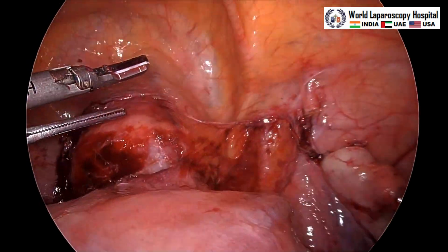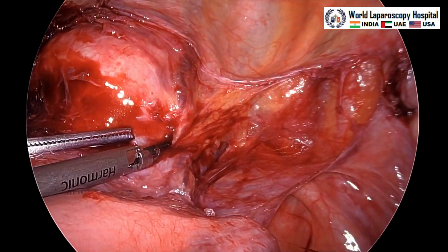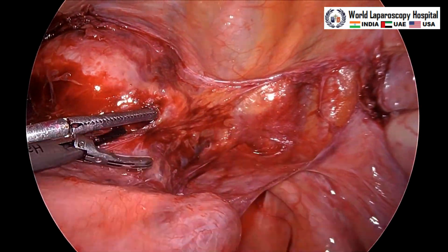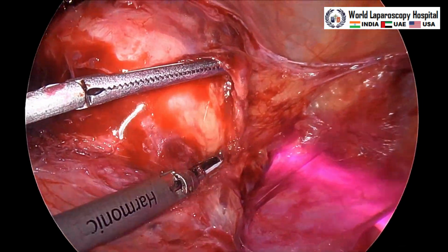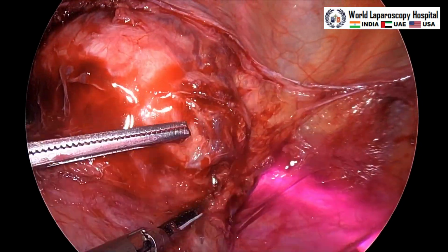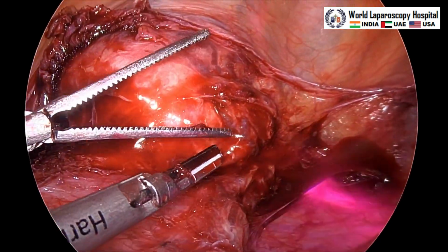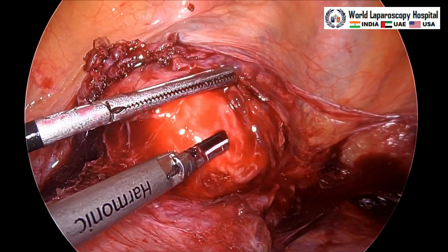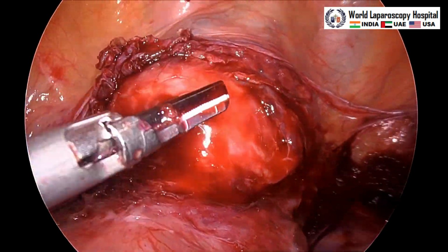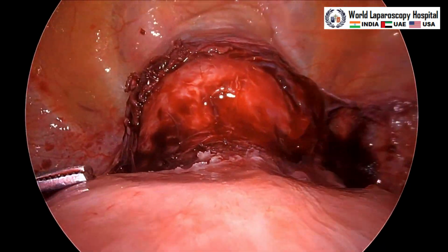Now again we will separate the bladder pillar of the right side, and further lateralization of this will be performed. This is an important step to minimize bleeding of the uterine artery, because if this area is thin, you have the proper pressure over the ligature, and you can do proper skeletonization and achieve hemostasis. So now it is over, and the entire bladder is separated.